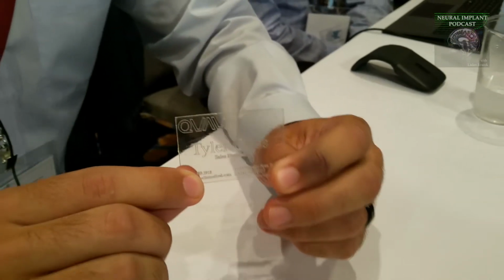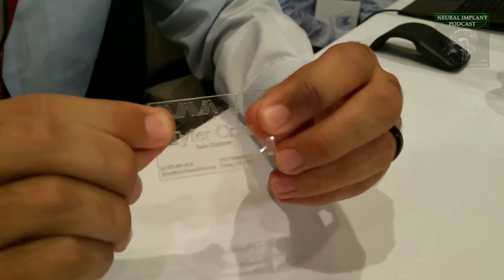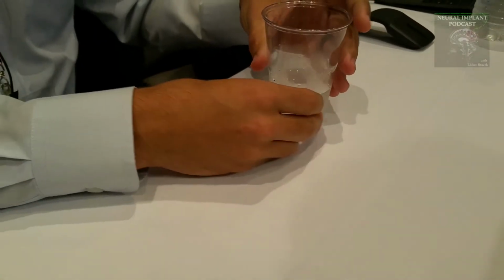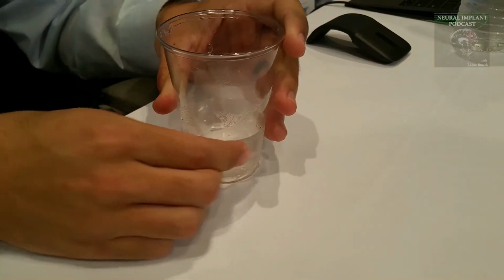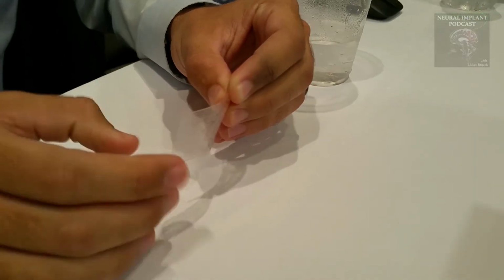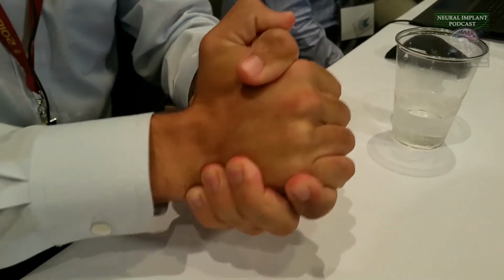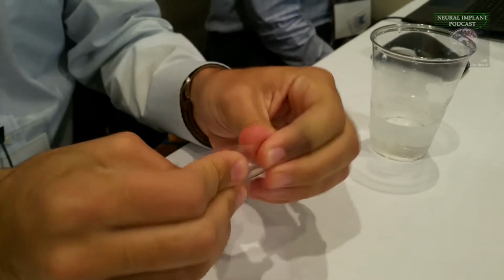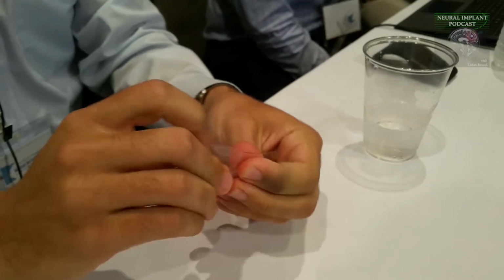This is a business card printed on that material. And so how does this work? The important thing about it is it has a very specific glass transition temperature, and we program that chemically to be very near body temperature, actually just below body temperature. And what that means is that at room temperature, if I exaggerate the effects by cooling it down a little bit, you can see that the polymer is quite stiff. It's actually around a gigapascal in terms of Young's modulus. And simply by heating it up in my hands, roughly at body temperature, a little below that, in just a few seconds, it transitions a few orders of magnitude in stiffness down to just a couple of megapascals.